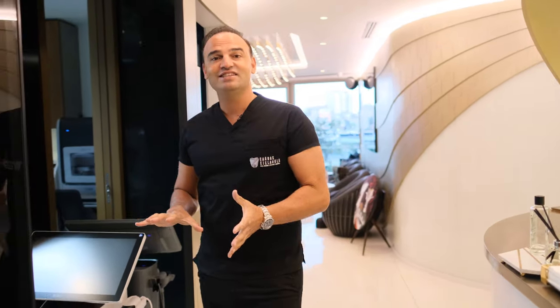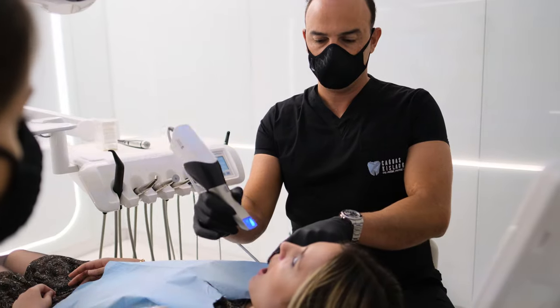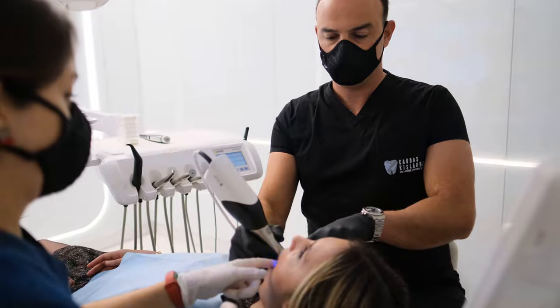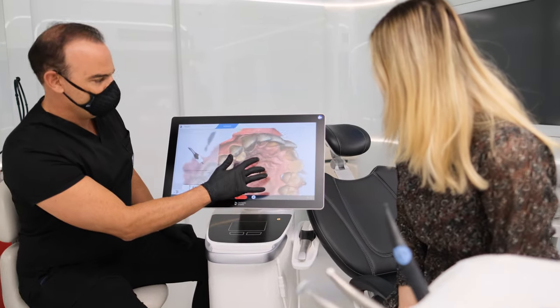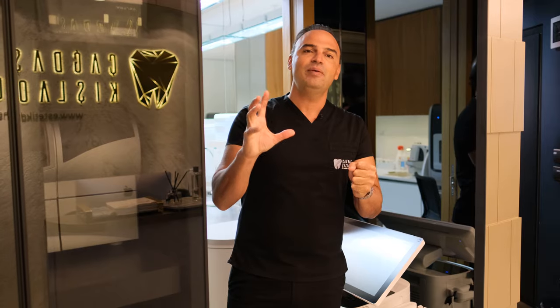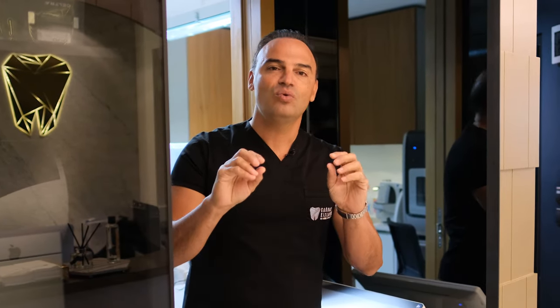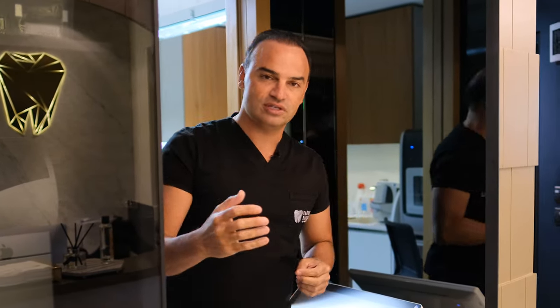I have two labs in my clinic. This is the digital part, where I make a digital scan for my patients. After that, on the computer we make a design and I produce the under layers. The over layers I like to make by hand — always natural effects with the magic powders.